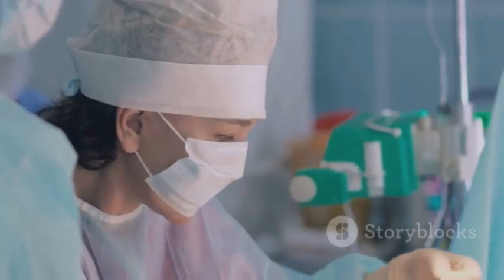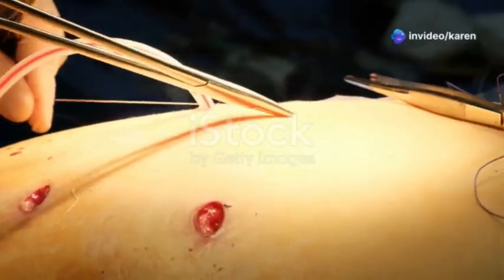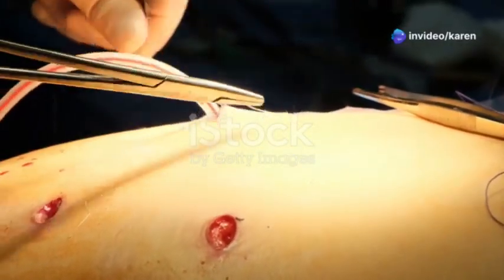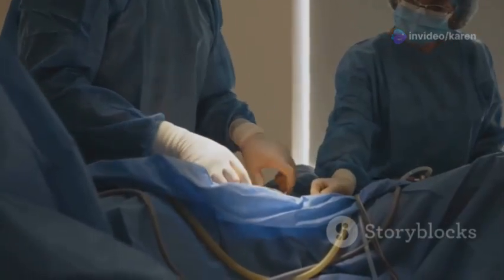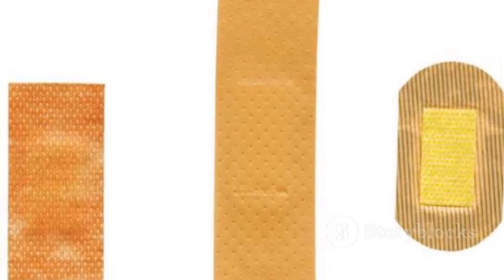Once the area is numb, the surgeon carefully brings the edges of the wound together. They use a needle driver to pass the suture through the tissue. The suture is then tied securely to close the wound. The number of sutures used depends on the size and depth of the wound.